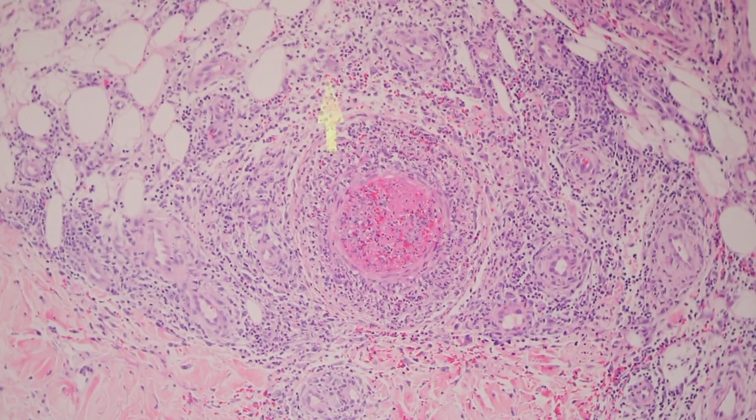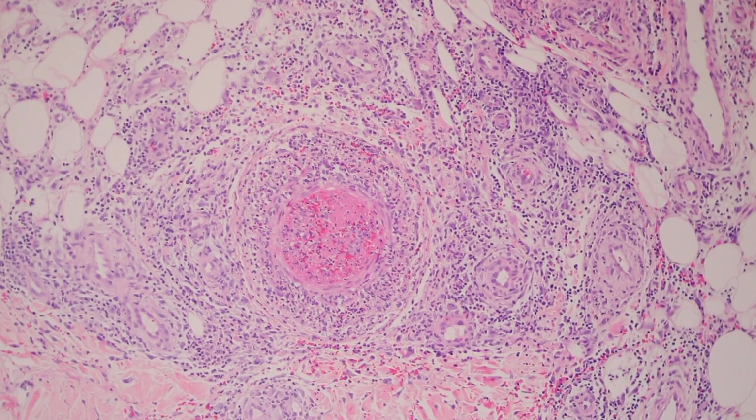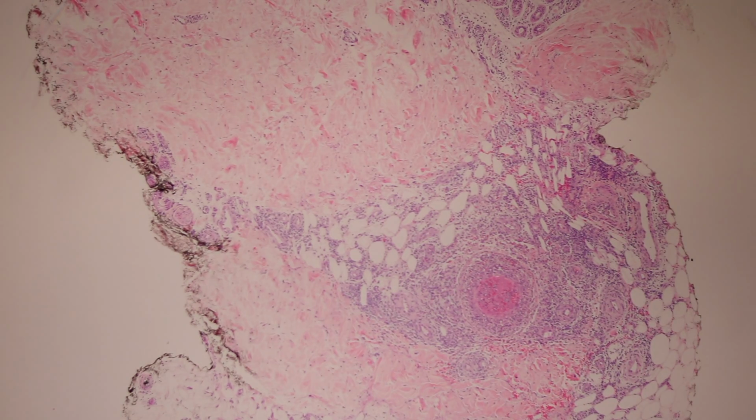So, a nice example of polyarteritis nodosa, and oftentimes these patients will have systemic internal organ involvement, so additional workup is going to be needed to exclude that possibility clinically. So that's a beautiful, just classic example of polyarteritis nodosa. All right.